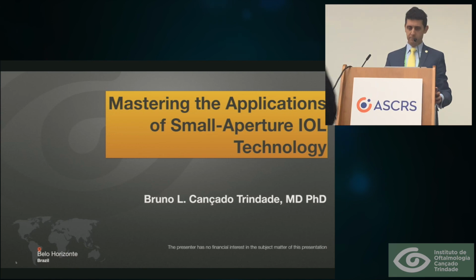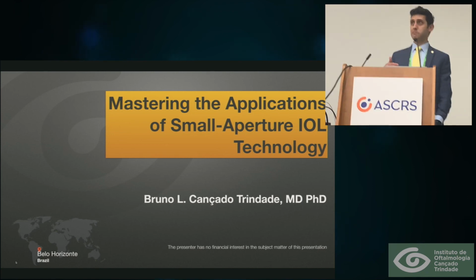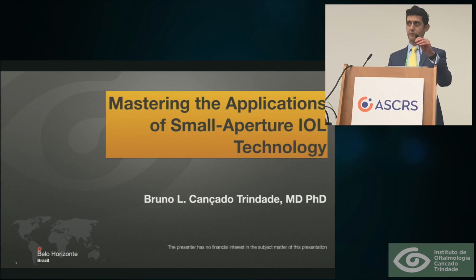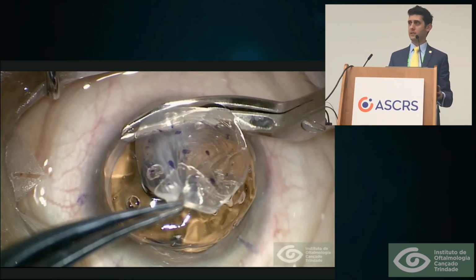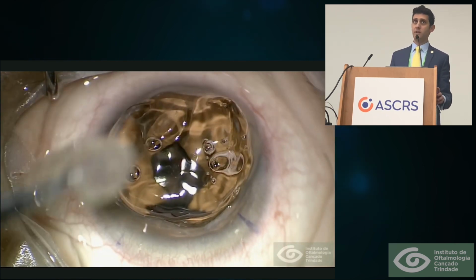Okay, so I'll just talk briefly about a case where I think there is a lesson behind it, and in which we're expanding the use of this technology, combining it with a different surgery as well. Basically we do mostly cornea surgeries, and I think everyone in this room who has done any corneal transplant agrees with me that we need to fear open sky surgery.